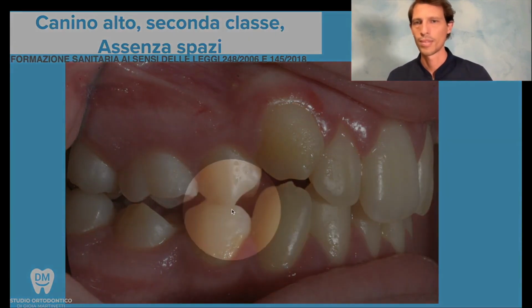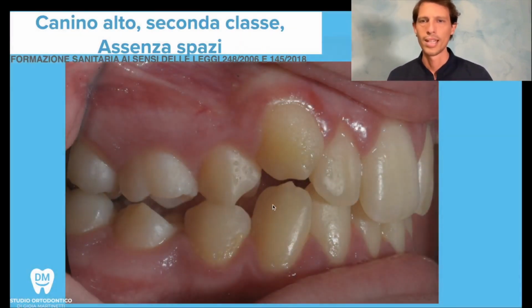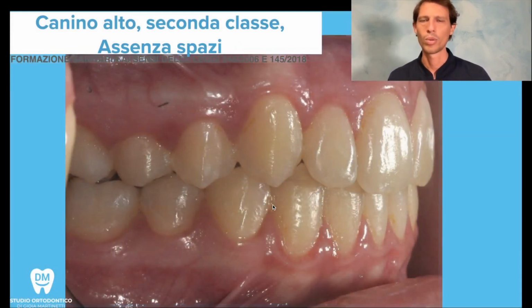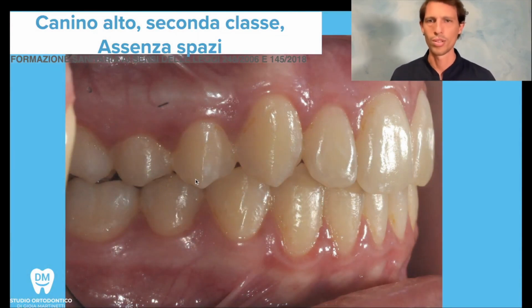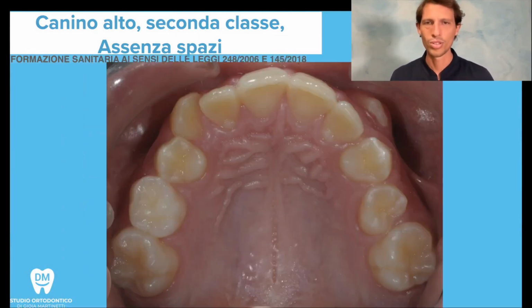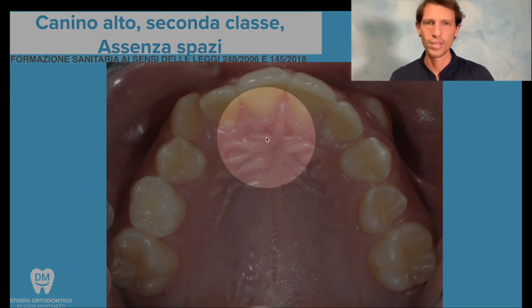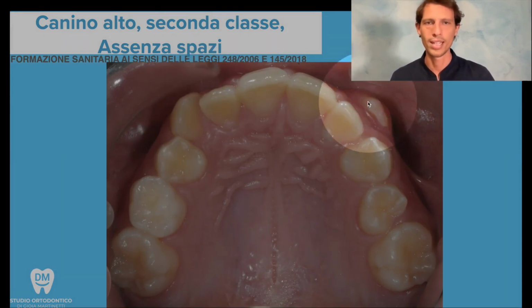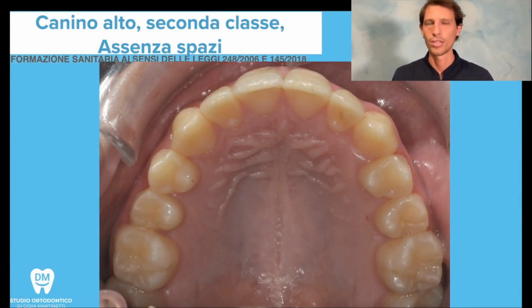You see, we start with 1 tooth against another, 1 tooth against another, and we end up achieving a perfect closure of 1 tooth against 2. This is truly a beautiful result. And so again, the upper arch, no space for this canine to come out, and then almost always a bit of magic. But in reality, it's the treatment with clear aligners, carried out, I would say, this time truly effectively.